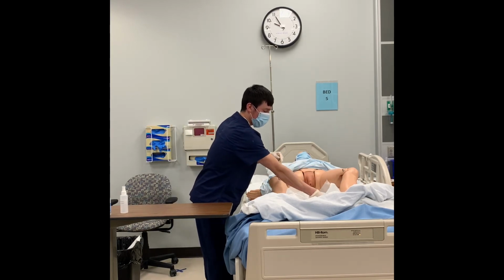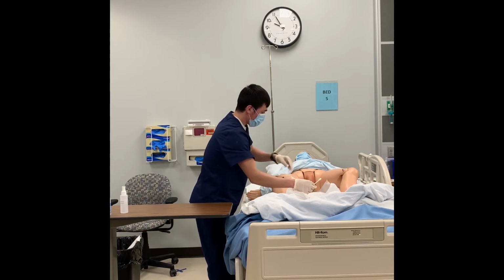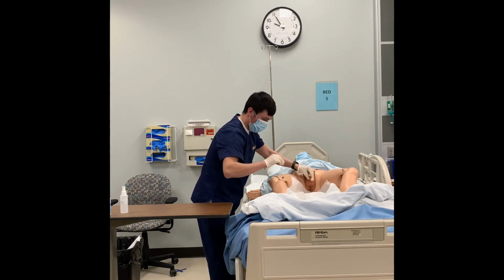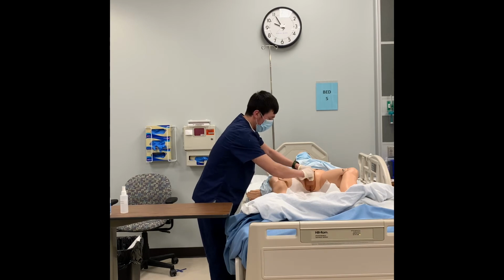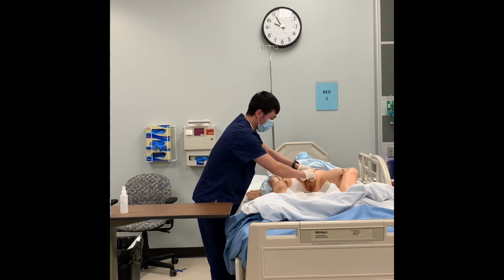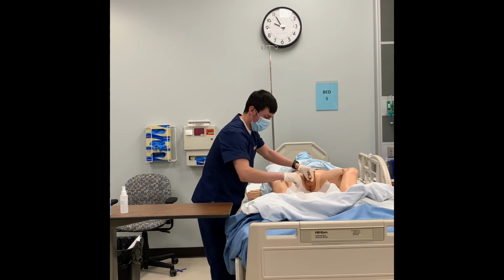And now I have to clean the area with my swabs. So grabbing at the base, starting close to the urethra, just around, and then I'm just throwing it. Close to the base, just a little further away this time, throwing it, and then the last one a little further away than that one before, and throwing it.